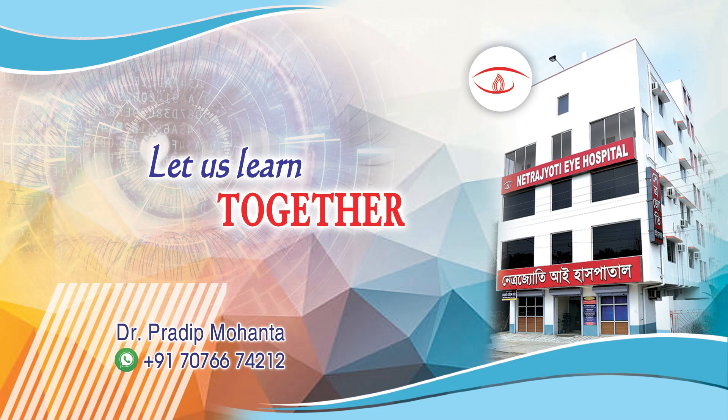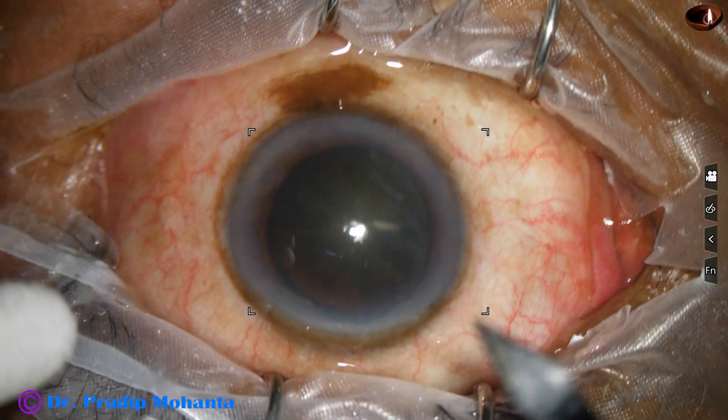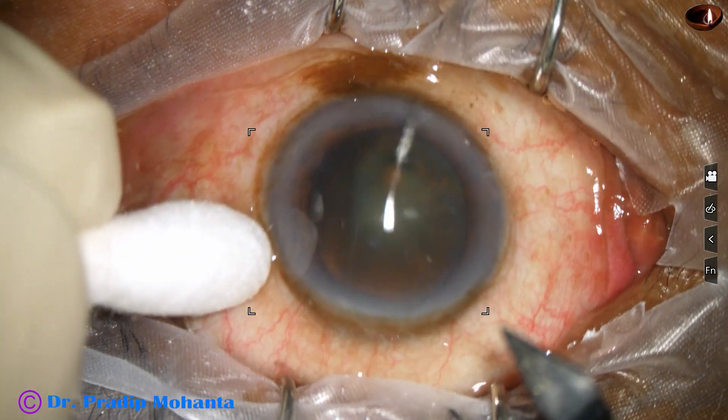Friends, welcome to my workplace at Ranakha, West Bengal, India. Let us observe this surgery — this is a routine surgery.